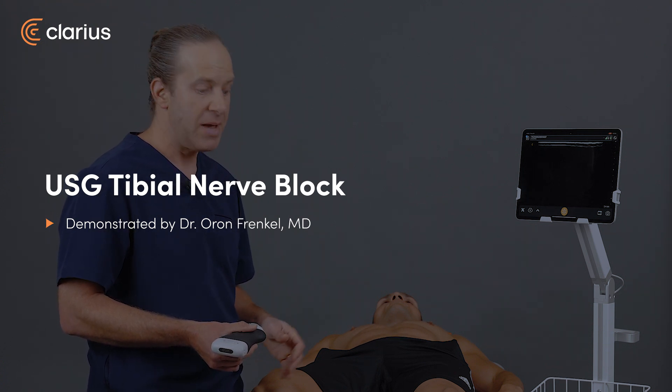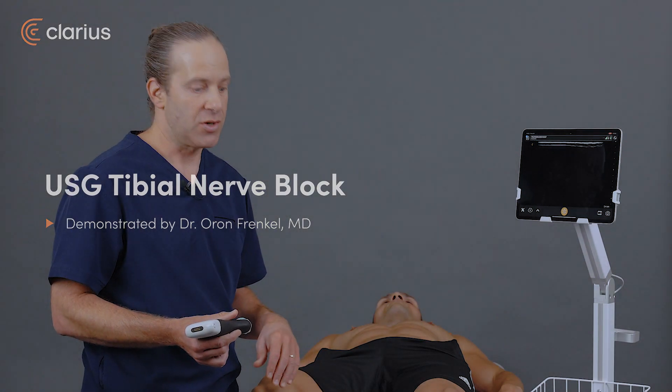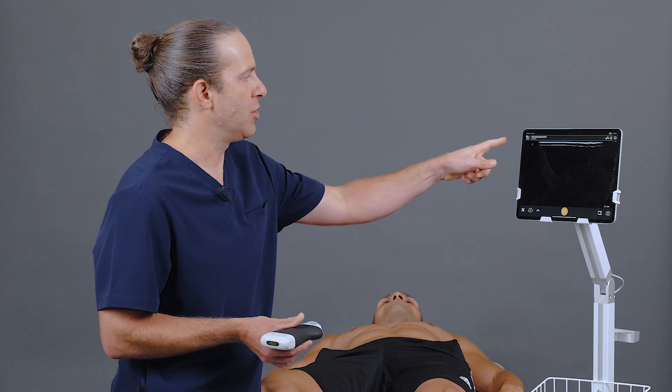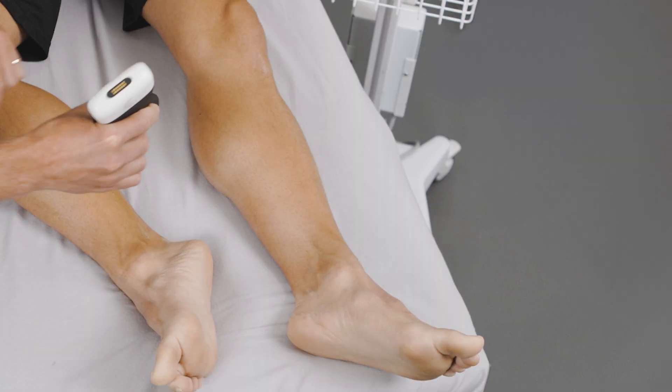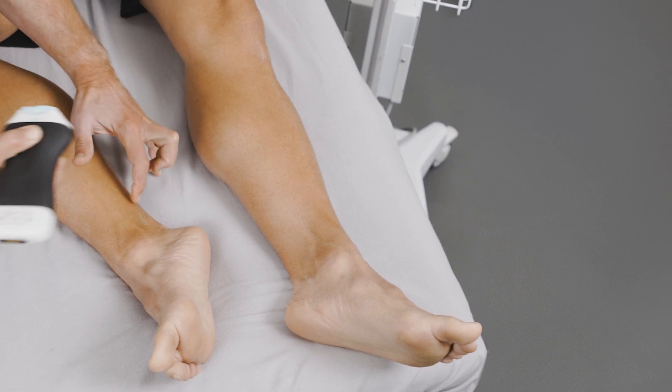The posterior tibial nerve block provides amazing anesthesia to the sole of the foot, where very few other limited options are available. To perform the block, I'm going to use the PAL scanner here on a nerve setting, and I'm going to place it in the transverse orientation, just proximal to the medial malleolus and posterior to it.